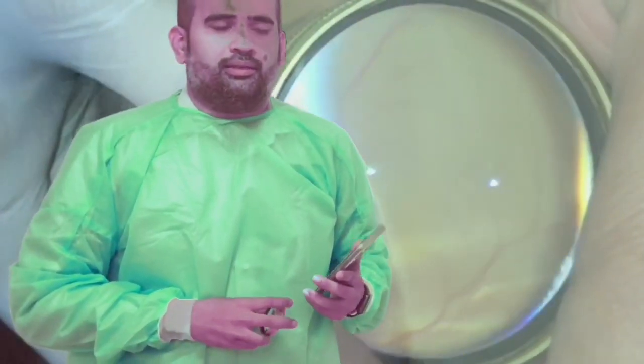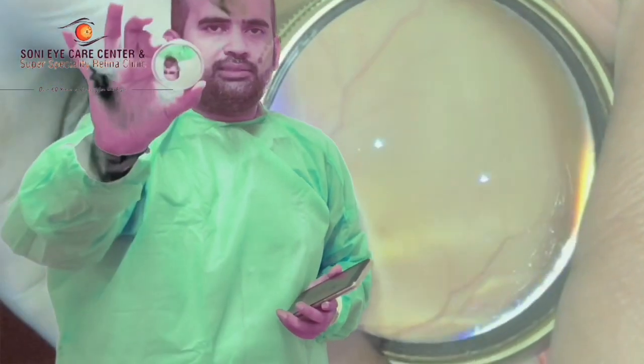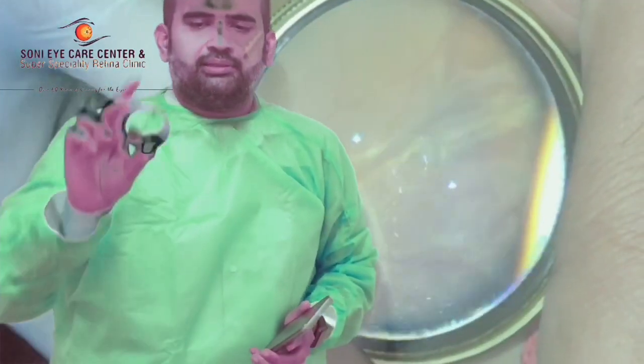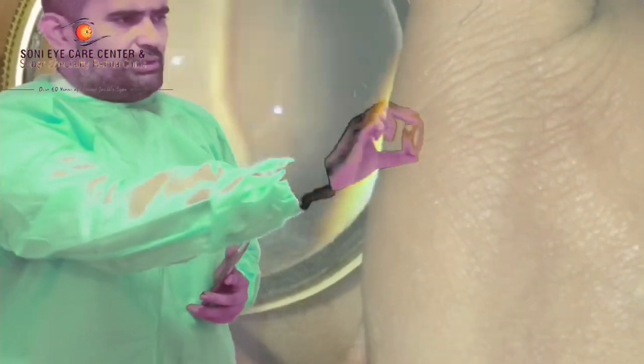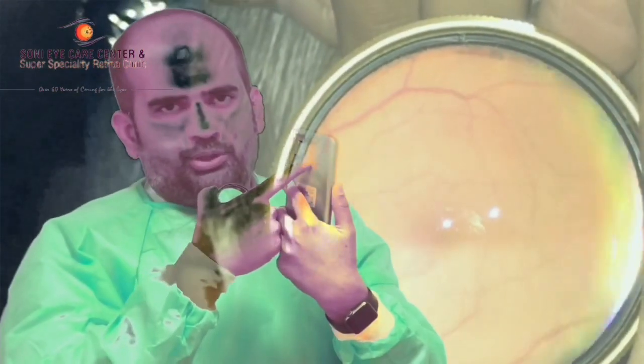Once you are ready with all the gadgets in your hand — the lens and the mobile phone — it's time to start. Just go close with the lens to the eye, as close as possible. Stabilize the lens close to the eye, turn the video mode on, and it is important that the flash is kept on.